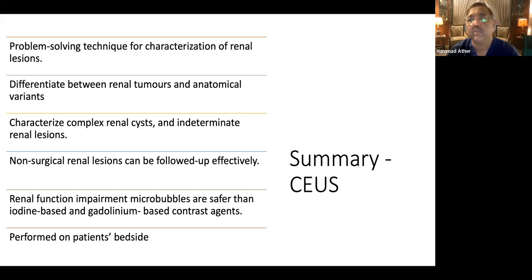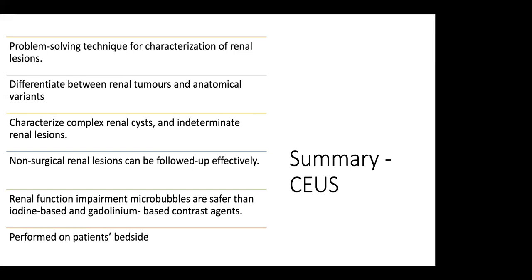It's very different from a CT or an MR that you see on a CD, and you can look at from various angles and reconstructions and so on. The same is not true for ultrasound. Basit, is that true? Yeah, you are absolutely right.